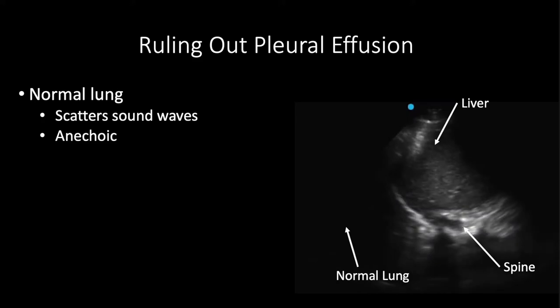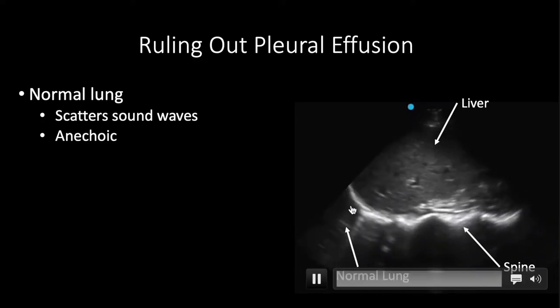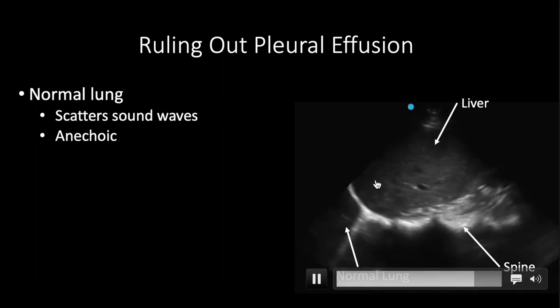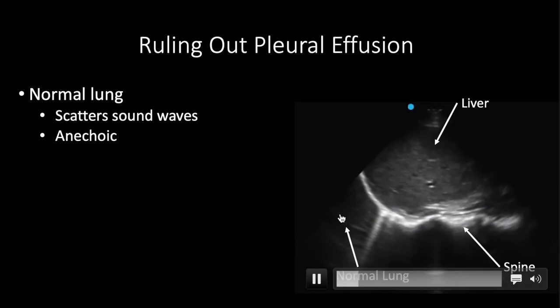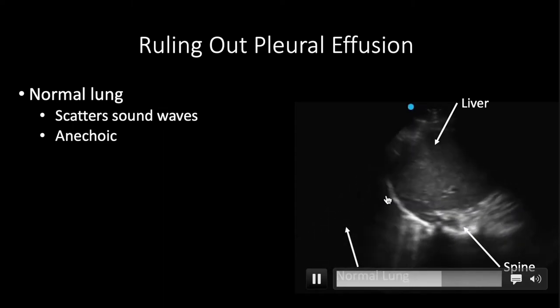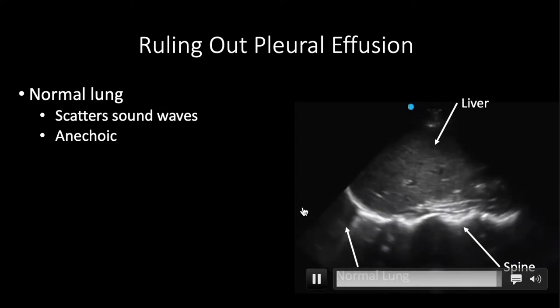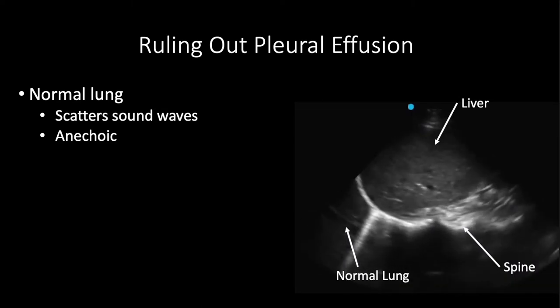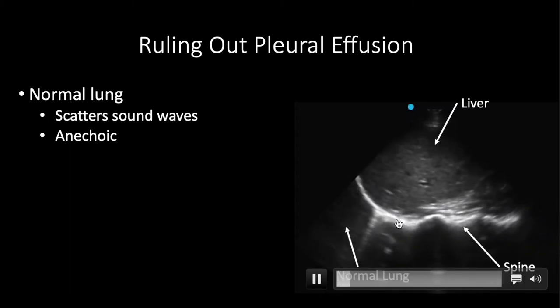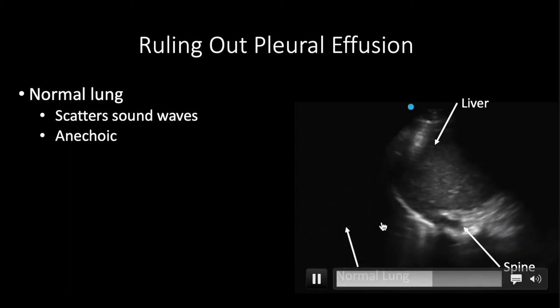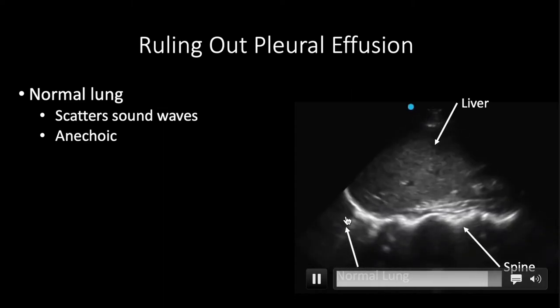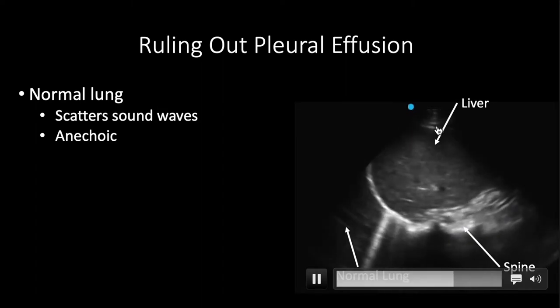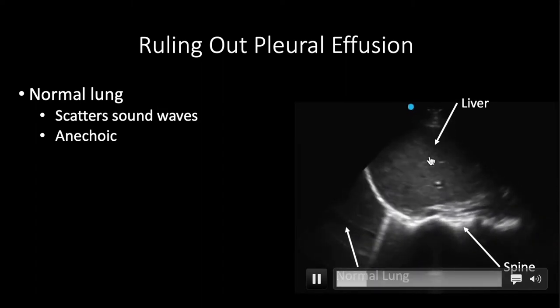The lung scatters ultrasound waves — they enter the alveoli filled with air and are lost, never returning to the probe. So we actually can't see through the diaphragm and it tends to be black above it. Sometimes you'll get a mirror image artifact where the lung looks like the liver — this echogenic material is similar to an A-line artifact, with ultrasound waves bouncing between the diaphragm and the probe.